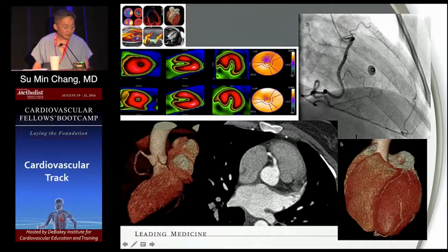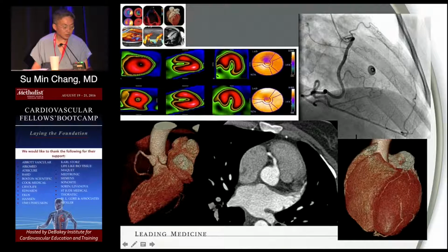Oh, okay. So if you see, the whole entire circulation is hinged on this right coronary, and you can see this distal apex right here has very little vessel. So it's a possible condition that obviously this area is viable, but it's probably not receiving enough coronary circulation during stress. As a matter of fact, there's nothing we could have done, and there's no therapy. And I think 1 month later, the patient came back with sudden cardiac death, requiring a defibrillator.